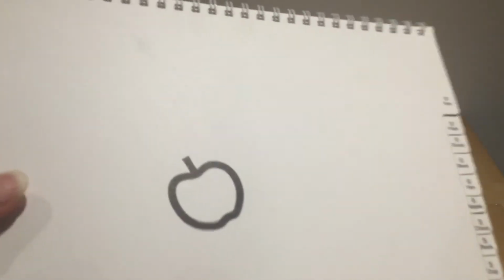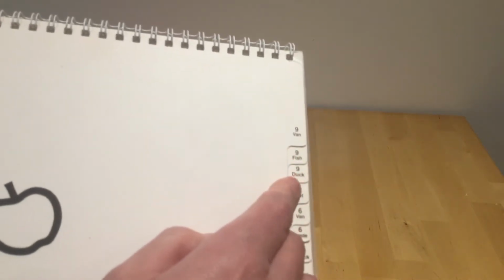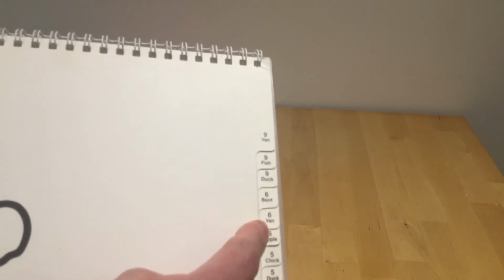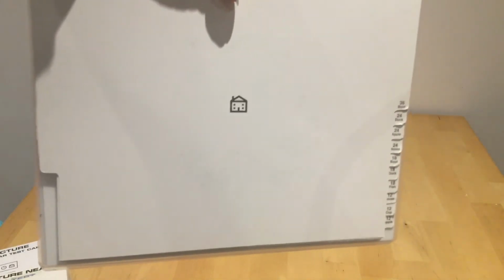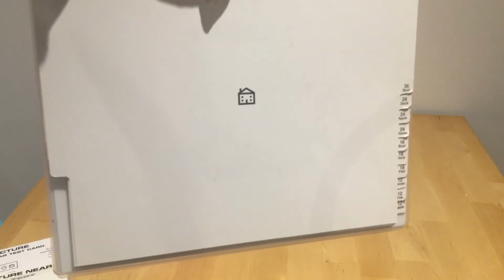Now if I keep the book on this side, when I now move to the right, you will notice that they're getting smaller. Pictures are on both sides. So you go through 9, 6, 6, and 6 would be regarded as being normal vision, but we actually go further in this screening booklet. So we go to 5, size 4, and size 3. So if I go for house size 4, you'll see that much smaller. And remember, you're doing this at 6 meters if you can, if not 3.